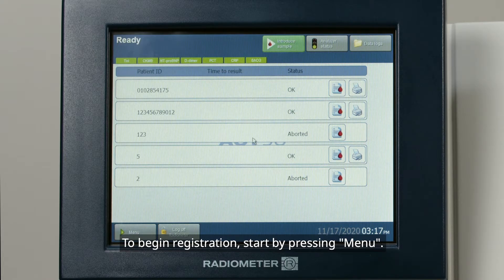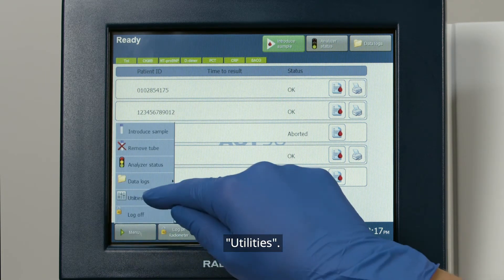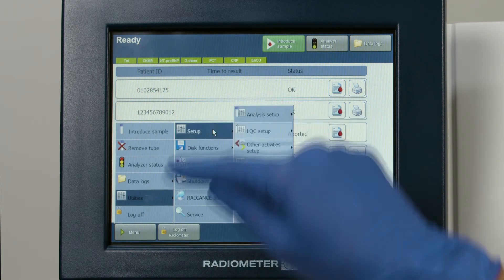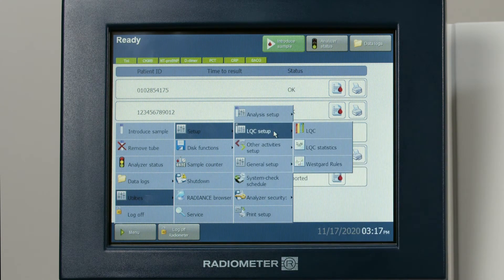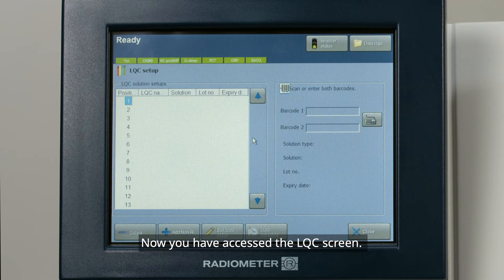To begin registration, start by pressing Menu, Utilities, Setup, LQC Setup, and then LQC. Now you have accessed the LQC screen.